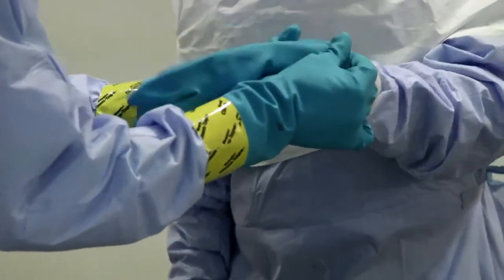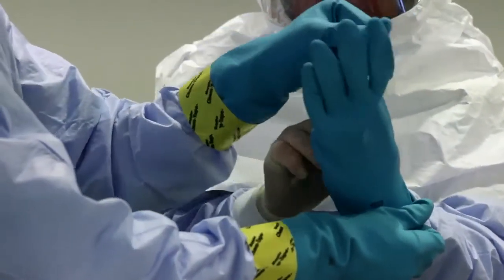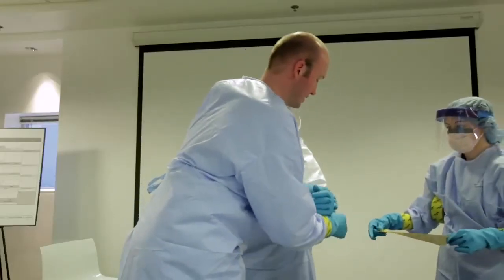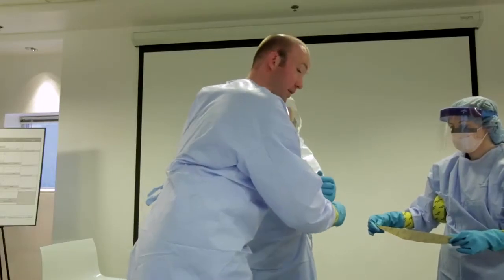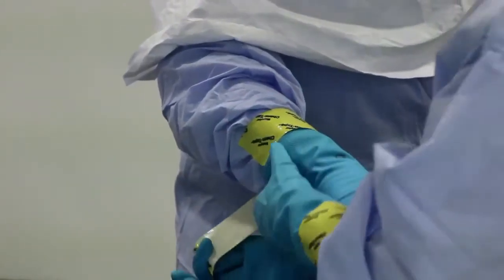The very last step is to put on what we consider his skin layer of gloves. These gloves are very, very thick — they kind of remind you of dish gloves — and even though he's got two layers of surgical gown, we're going to put this cuff on the outside and tape it down to make sure no gaps appear. The purpose of that is so that when we take this outer layer off, the gloves come with it rather than having to take the gloves off separately.